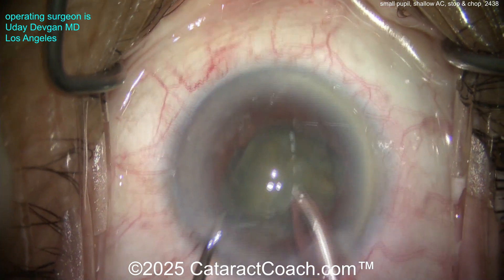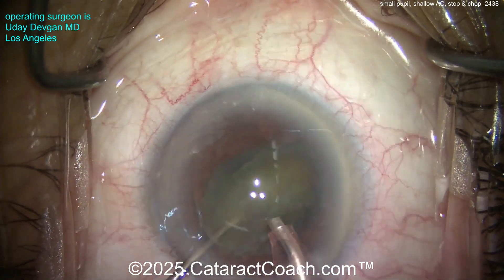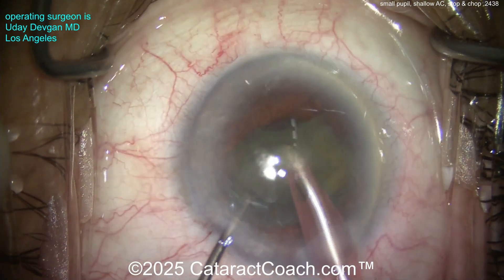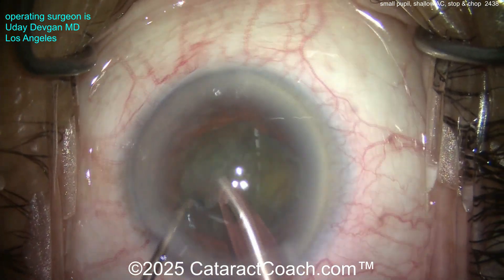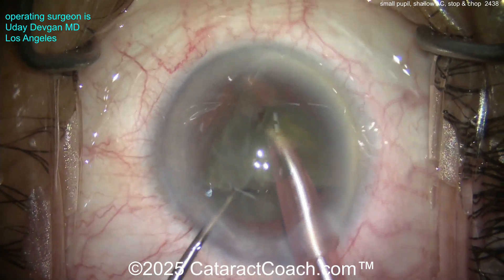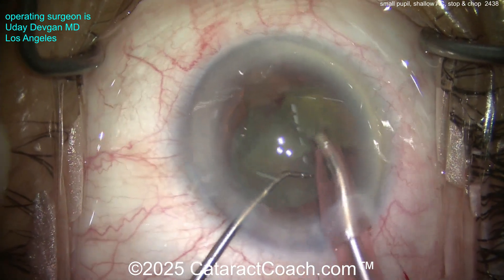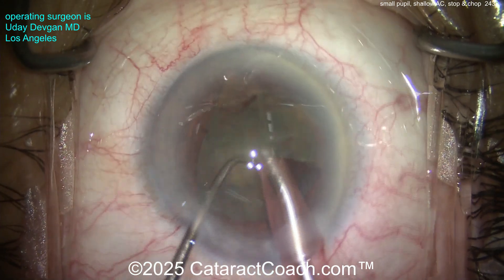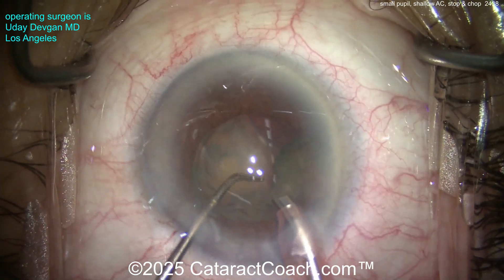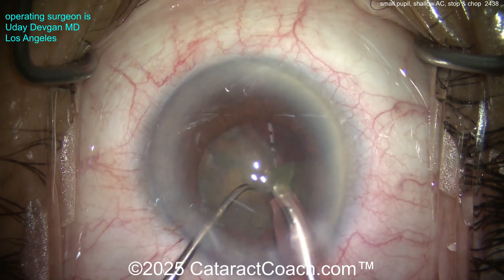Once they're split, I can click over to the higher vacuum mode. Make sure they're totally free from each other, then bring one up — notice how the chopper pulled one half away while the phaco probe brought the other half up to the iris plane. The second half is in the bag, holding it down. I'm just bringing up little bits to the iris plane to emulsify. Luckily, not a very dense cataract, so it should be straightforward.